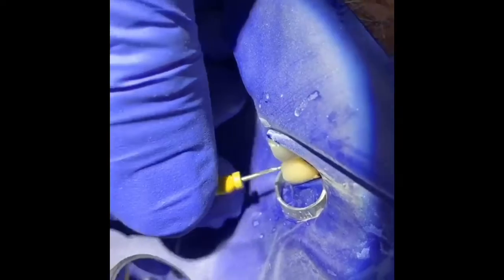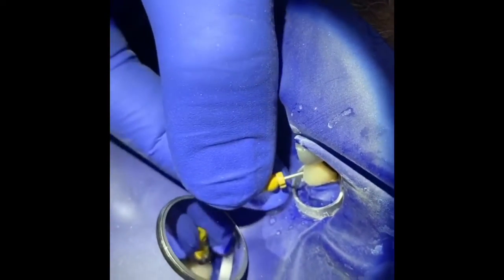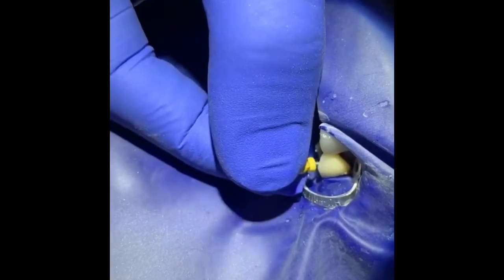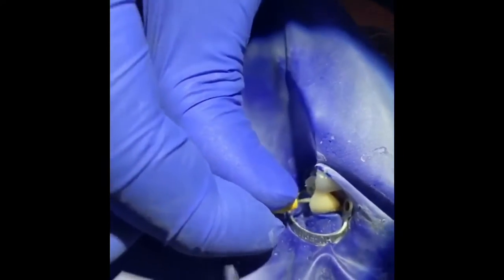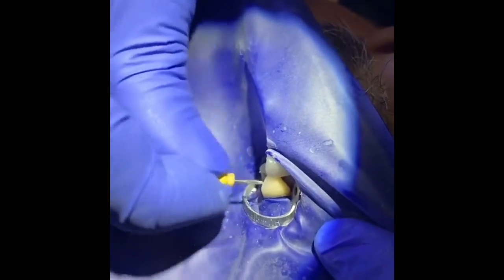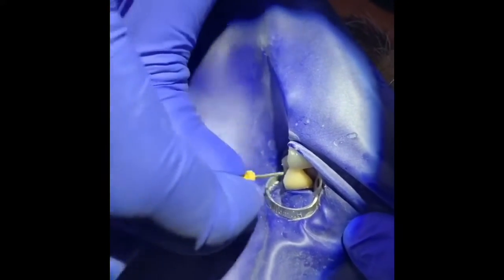I'm going to use the 50 to condense and push the MTA to my working length, which was 24 millimeters. As you can see, I've condensed enough — I cannot go all the way to my working length, I'm about four or five millimeters short, which means I'm condensing really well.